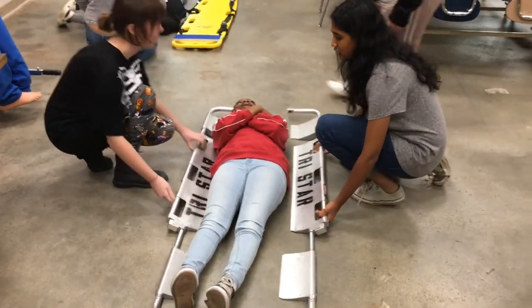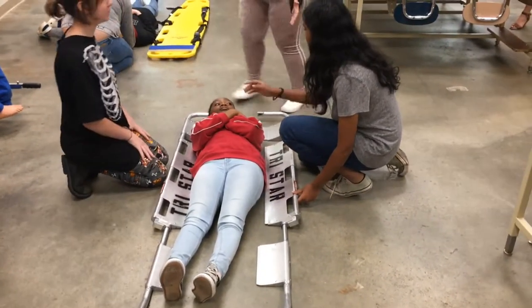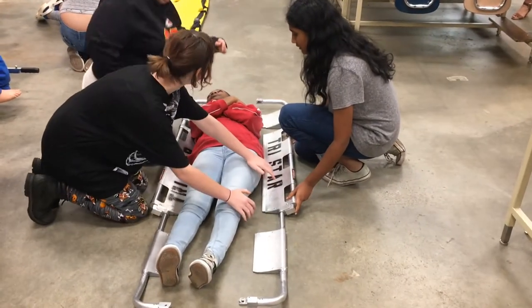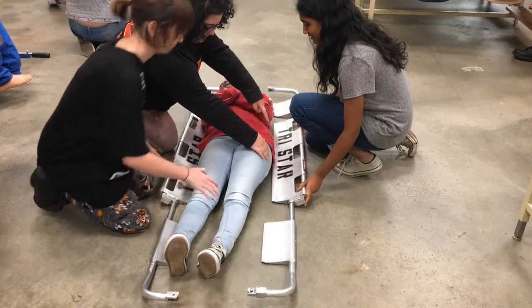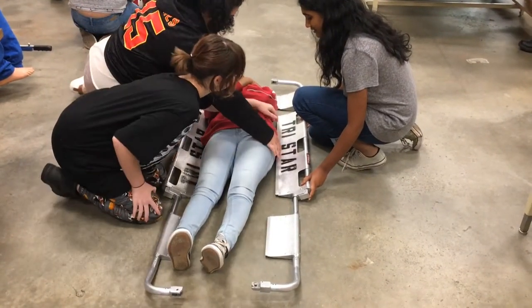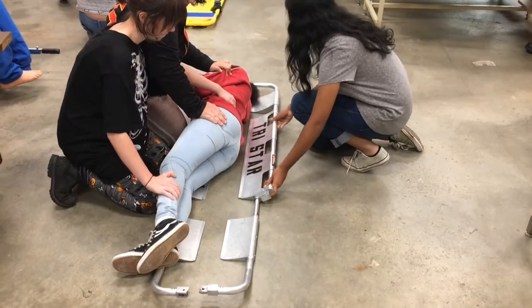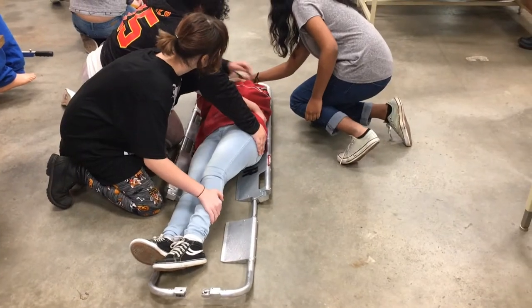You place the stretcher halves on both sides of the patient. Then you want to gently lift or roll the patient toward one side, scoop the stretcher gently under the patient, and then roll them back.